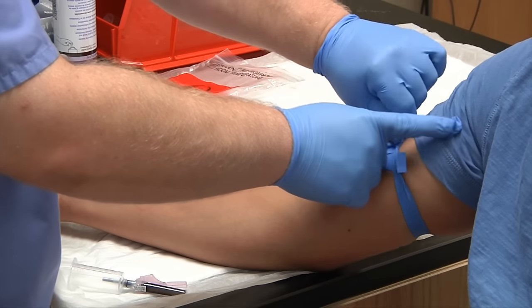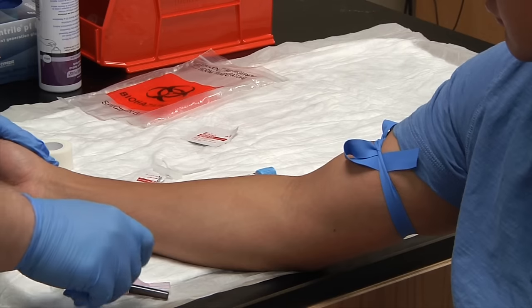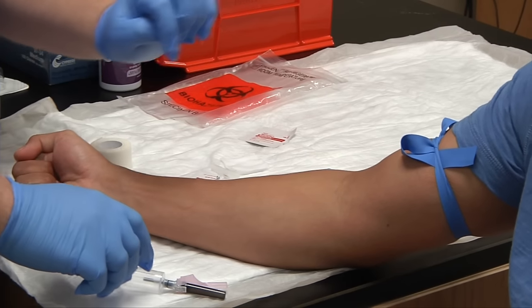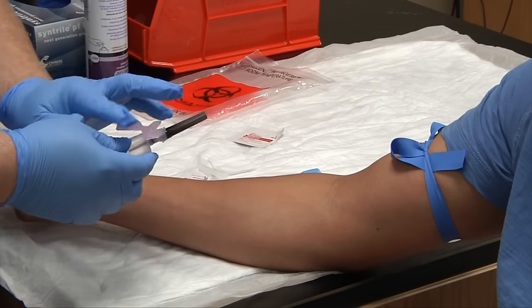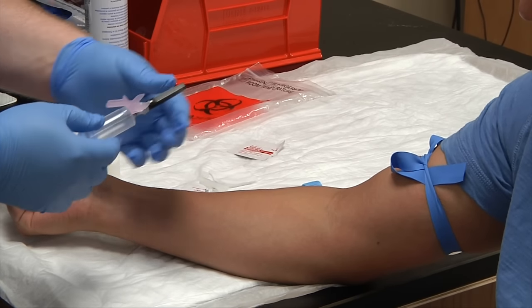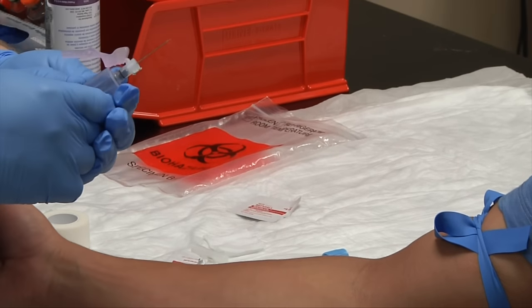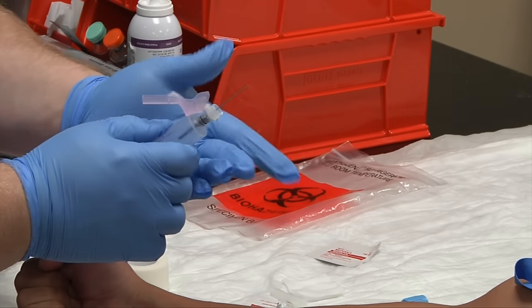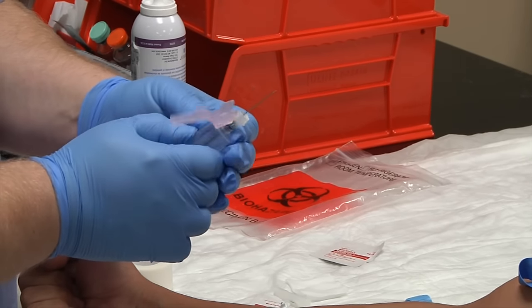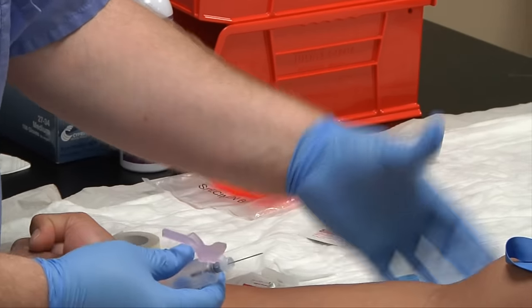With my tourniquet on, I ask my patient to make a fist. I cannot touch the site anymore since I've cleansed it. I'm going to pull back the safety cap of my needle in a downward one motion. Check your needle — make sure you have bevel up, with no barbs, shards, or any bent material on the needle. Everything's good with this one.